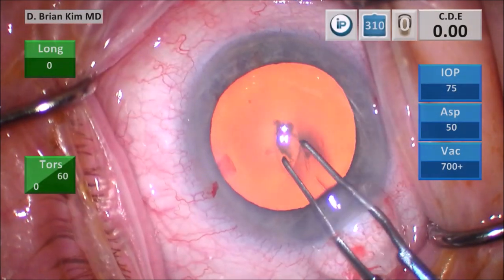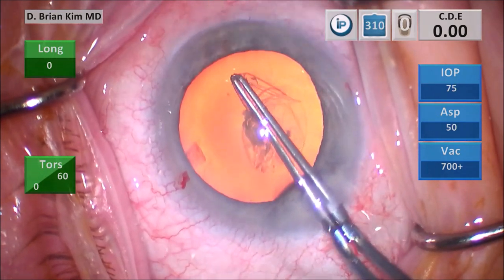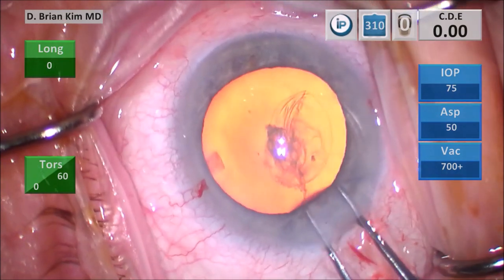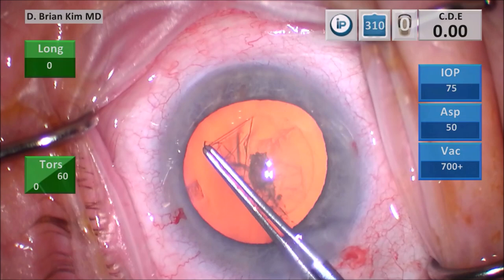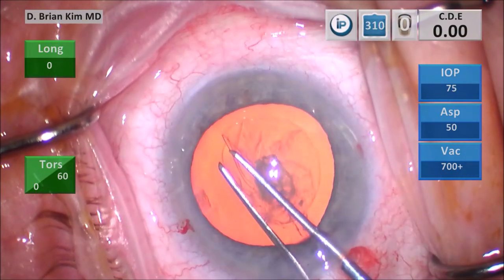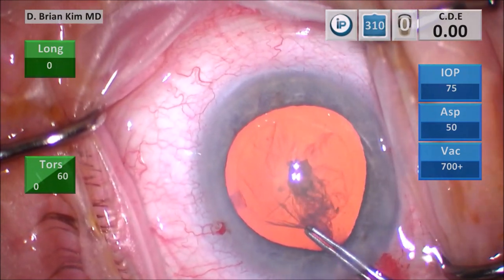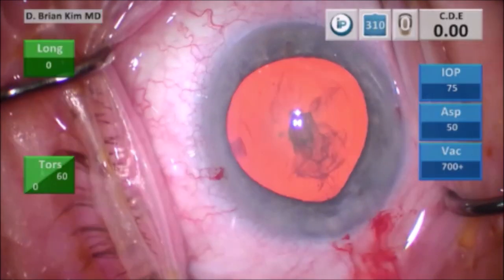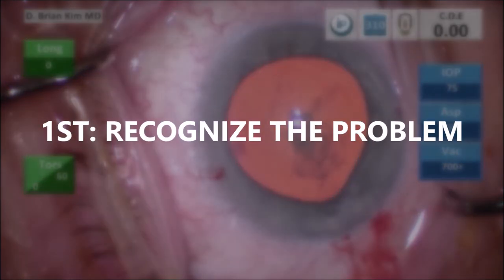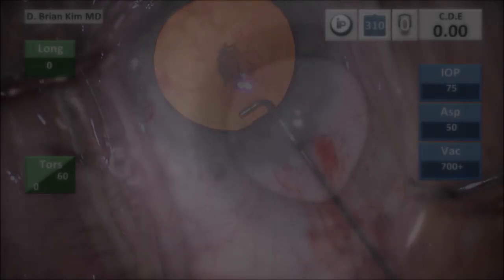I make my puncture with my capsulorhexis forcep and go ahead and make my capsulorhexis in a counterclockwise manner. During these maneuvers, I'm doing a very careful re-grabbing of the capsulorhexis, but there is absolutely no indication that the iris is floppy at this point. A little bit, maybe, as I'm manipulating the capsulorhexis forceps — you can see a little bit of peaking to the wound. I always like to burp viscoelastic after I do my rhexis, and you can see a little bit of peaking of the pupil towards the incision. That's the first thing — you want to be able to recognize the problem.